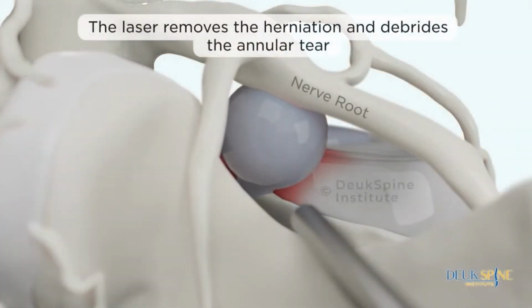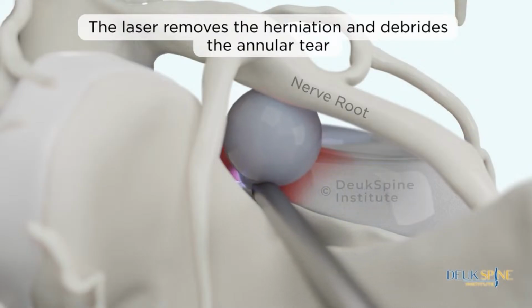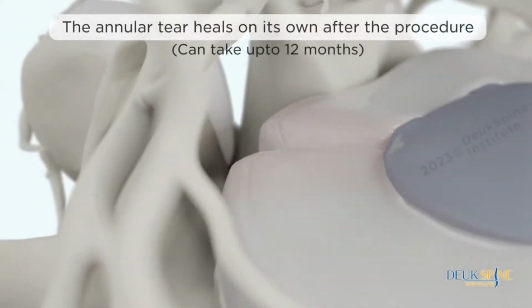The laser removes the herniation and debrides the annular tear. The annular tear heals on its own after the procedure, which can take up to 12 months.